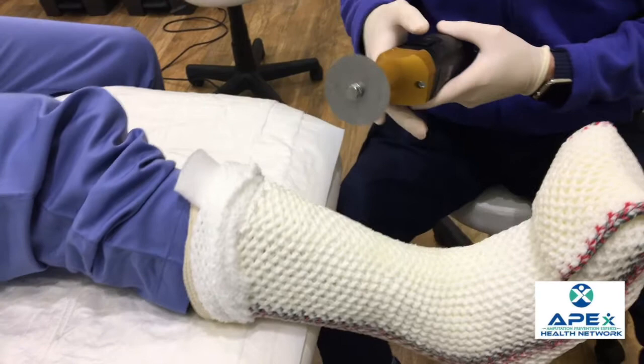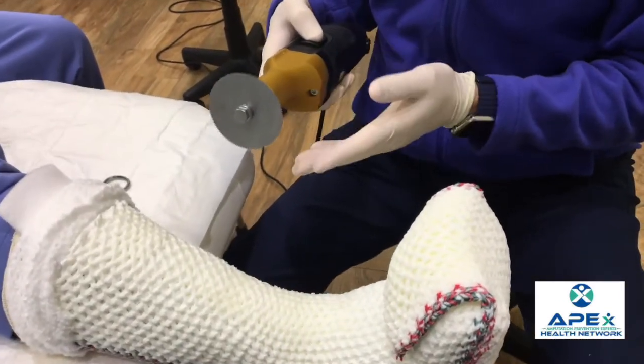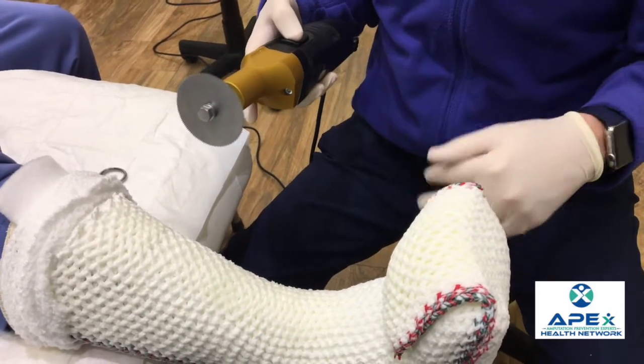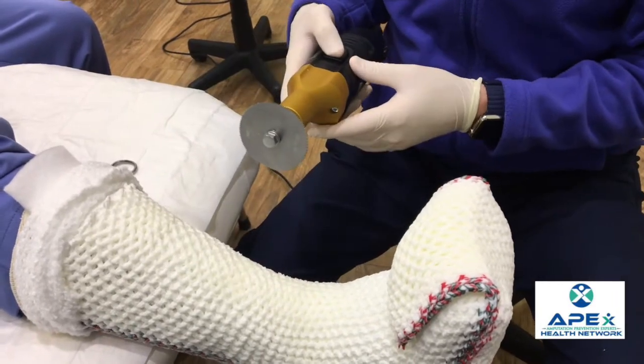You can either use a cast saw with a vacuum or without a vacuum. This one does not have a vacuum. If you don't have a vacuum, you want to use a mask to be careful not to inhale any of the dust that comes out of it.